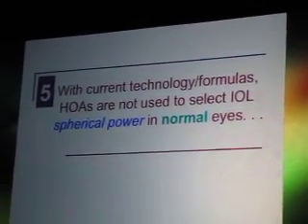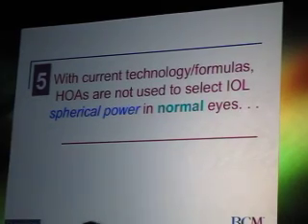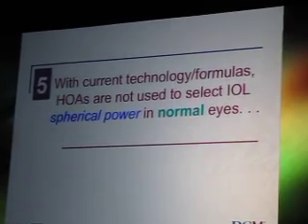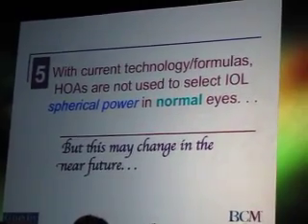Number 5, with current technology and formulas, higher order aberrations are not used to select the IOL spherical power, the dioptric power in normal eyes. But I think this will change in the future. Progress is being made.